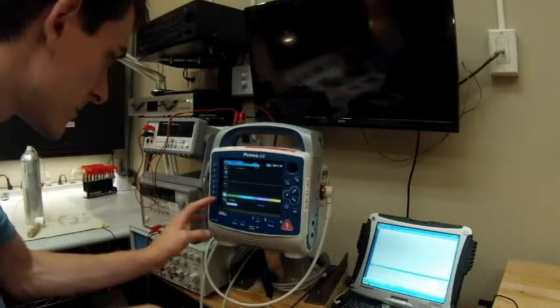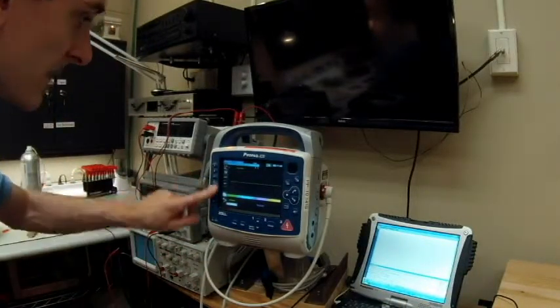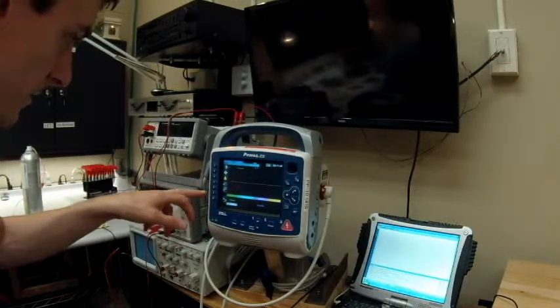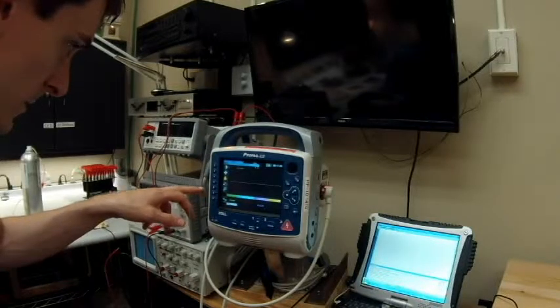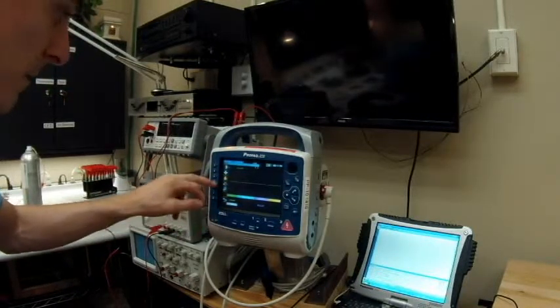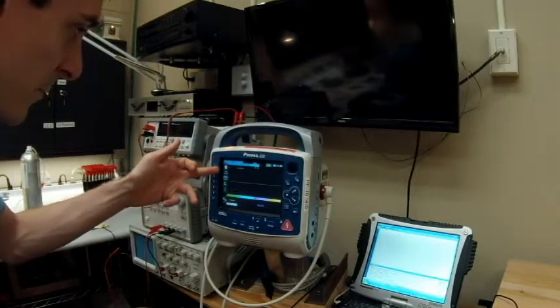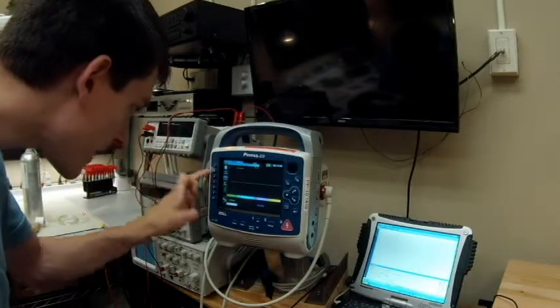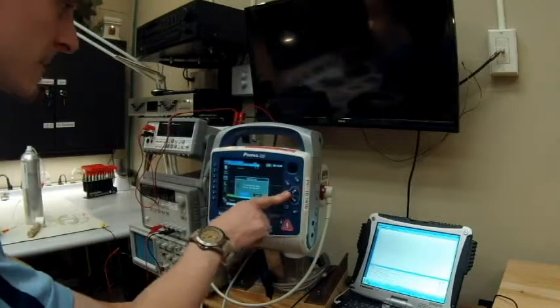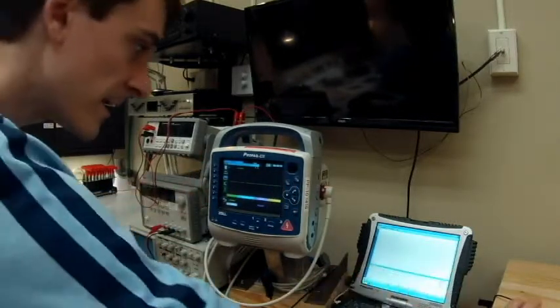We're going to find the trash can on the soft keys, hit the back button, and go to the log. There's a log button right underneath the yellow bell. Once the log comes up, we can see the treatment, print trends, print to USB, and delete. We want to delete all the logs.